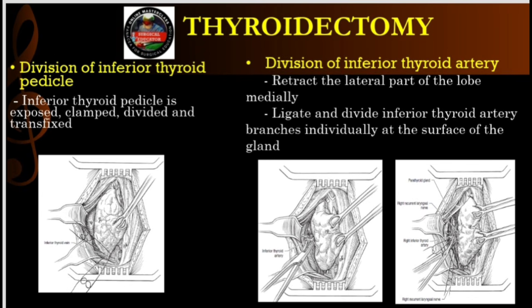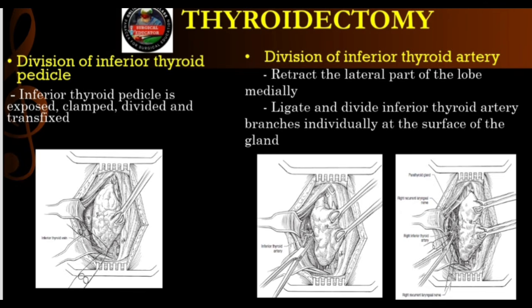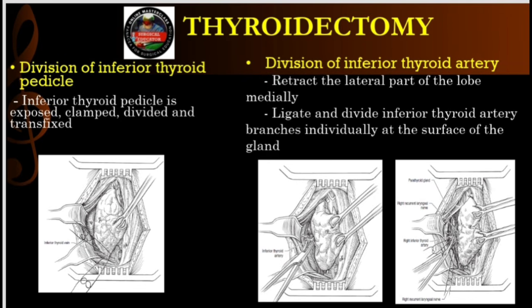Up top, we stayed close to the gland. Here... wait, no, it's the exact same physical action. We stay on the surface of the capsule. Yes. We like it at the capsule, but for completely different physiological reasons.